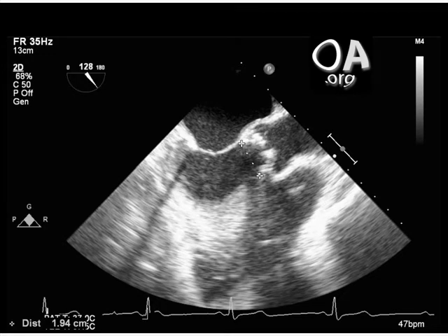This is the diameter of the left ventricular outflow tract in the mid-esophageal aortic valve long axis view, measured to be 1.94 centimeters. So the radius is 0.97 centimeters. To obtain the cross-sectional area, the radius is squared and multiplied by pi. Thus, the cross-sectional area of the left ventricular outflow tract is 2.95 centimeters squared.